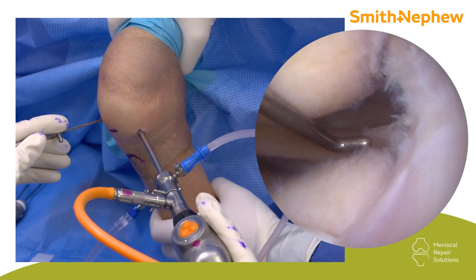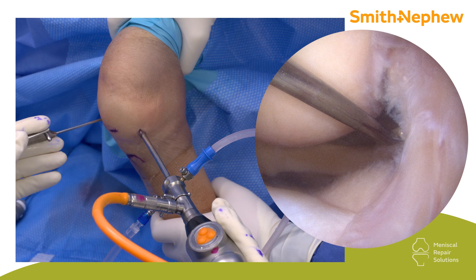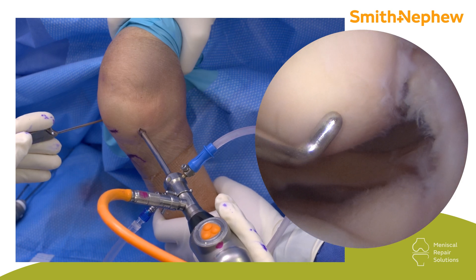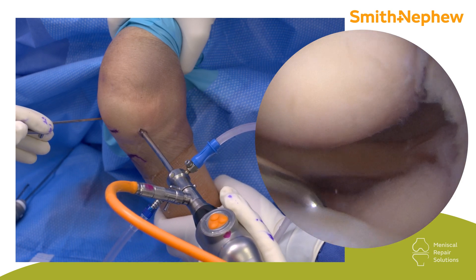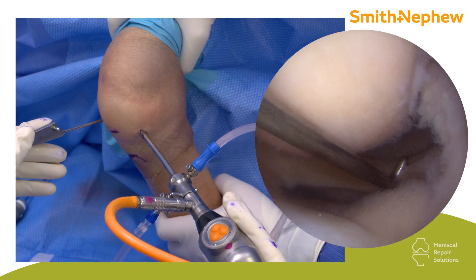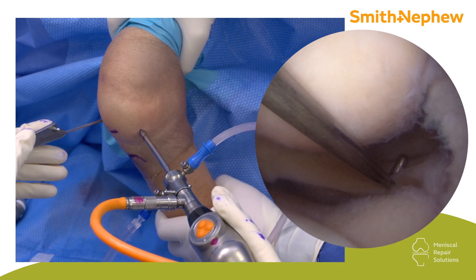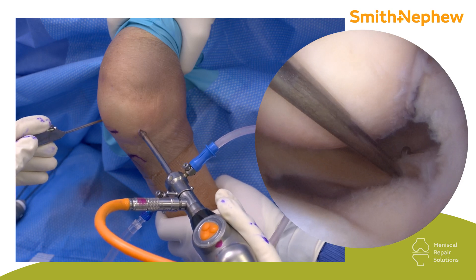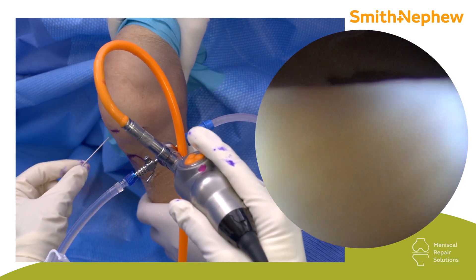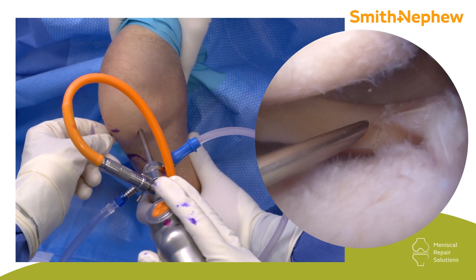You can see if you follow the trajectory of my portal here. Here's your ACL, which in most of these cases will be torn — in your treatment of an ELMORT tear you will not have an ACL. Here's the lateral condyle, there's the lateral plateau, this is the anterior root of the lateral meniscus, and here's the posterior root. If you look at the trajectory of your standard viewing portal, you will not get good exposure for your repair. So either you prepare a low lateral portal, which is what I'm doing, or you can switch portals. You create a low anterior lateral portal over the anterior root — like so — and then you have great access right to the meniscus.